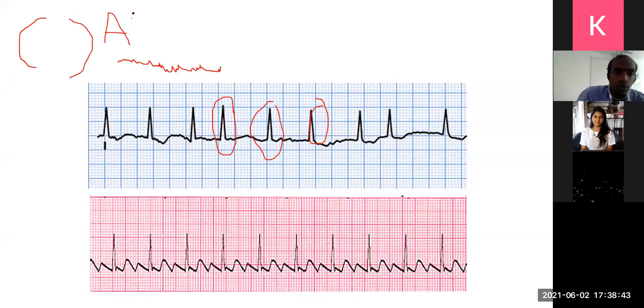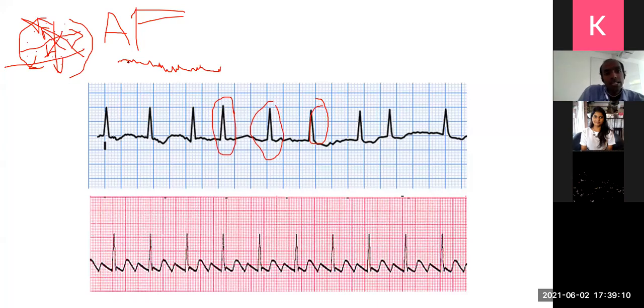This ECG I'm going to explain now. That is because you get thousands and thousands of small currents everywhere in the atrium. So essentially, current is going all over the place, like traffic, everything goes everywhere. The P wave is broken into thousands and thousands of pieces.